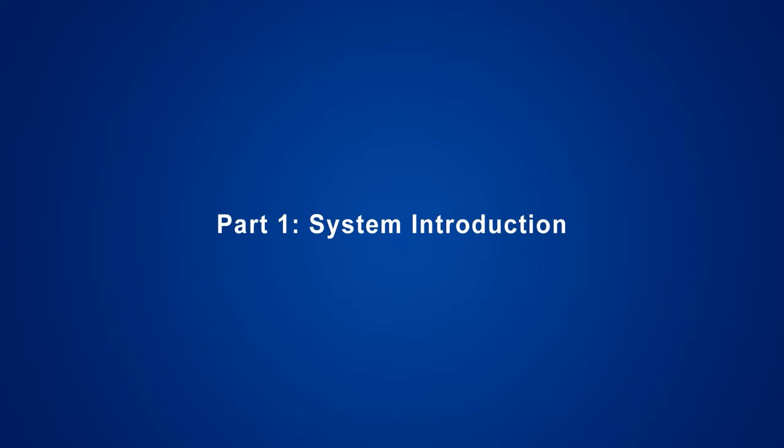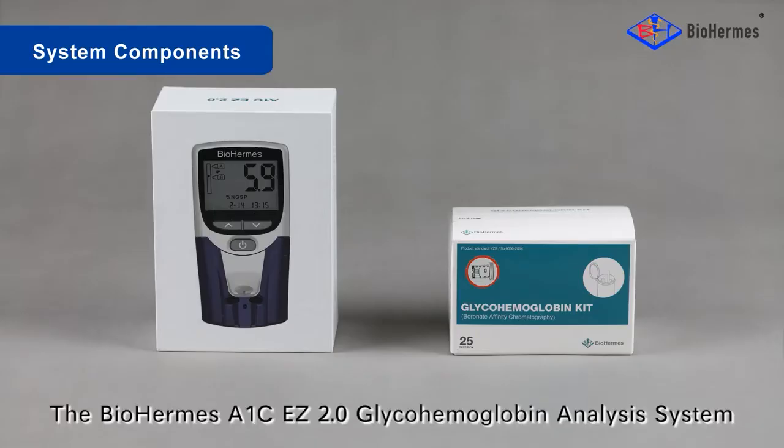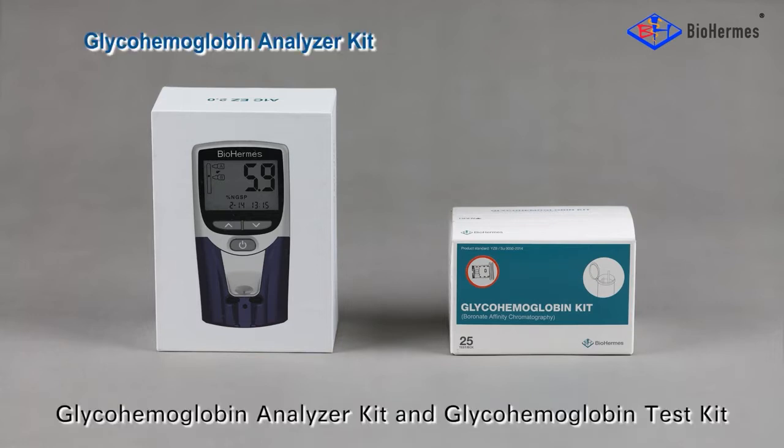Part 1: System Introduction. The BioHermis A1C-EZ 2.0 GlycoHemoglobin Analysis System consists of two parts: the GlycoHemoglobin Analyzer Kit and the GlycoHemoglobin Test Kit.